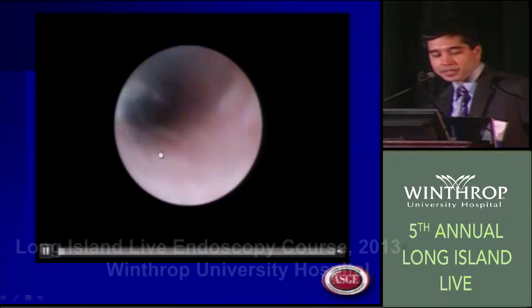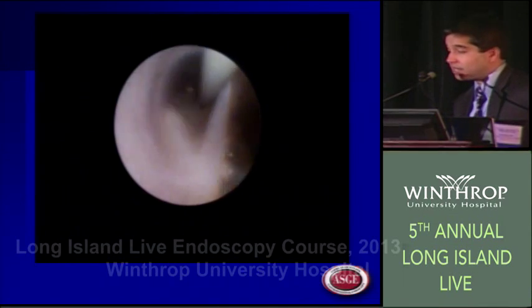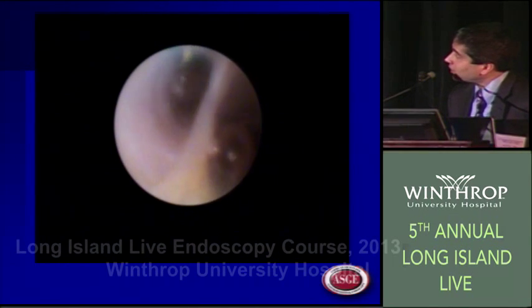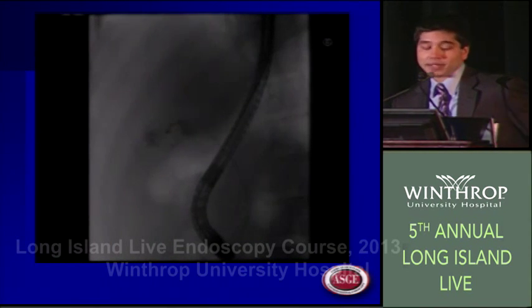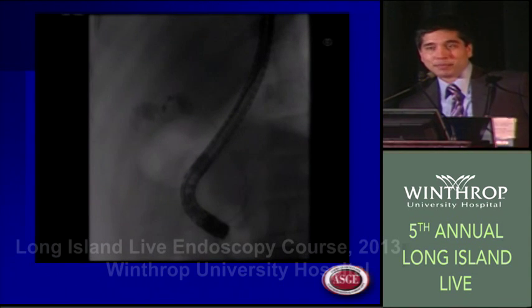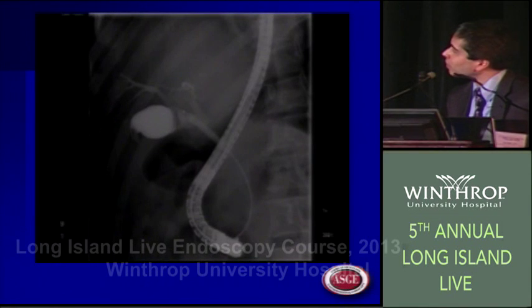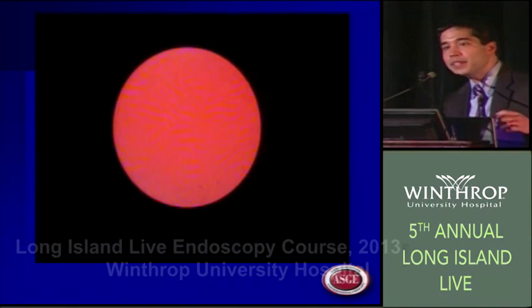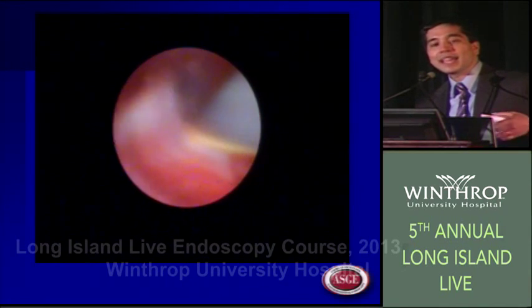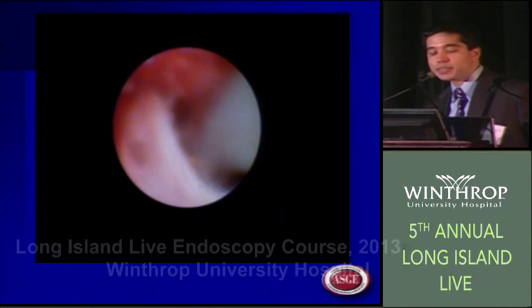so this is an example using cholangioscopy, and we actually had a little trouble getting into the cystic duct selectively. So this is the wire going into the cystic duct, and that was the lumen to the main portion of the bile duct. So we used the cholangioscopy guidance to help us steer our wire in the right direction. And then you'll see some filling. I'm sorry if it's a little dark for you, but that's the area where the stone is. Now that cystic duct and the valves of Heister are pretty resistant to passing devices through there, and there's a stricture there too. So we initially attempted cholangioscopy, were unable to do it, so we had to dilate.